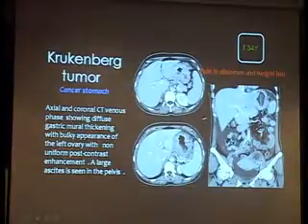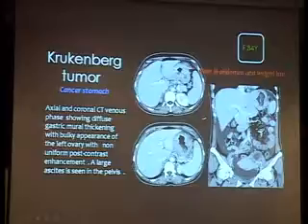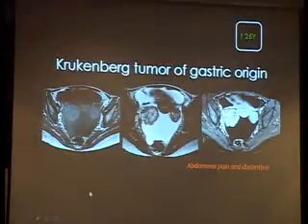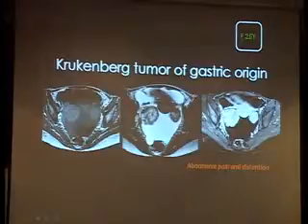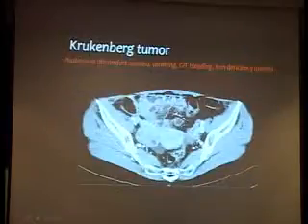And in the study, you can see the tumor itself. Here you see a diffuse, significant gastric mural thickening and an ovarian lesion which should represent a Krukenberg tumor. And this is MRI T1, T2, and T1 with contrast and fat suppression. You see bilateral ovarian masses that are more or less solid. They enhance strongly after injection of contrast, diagnostic of Krukenberg tumor in a patient with gastric carcinoma.